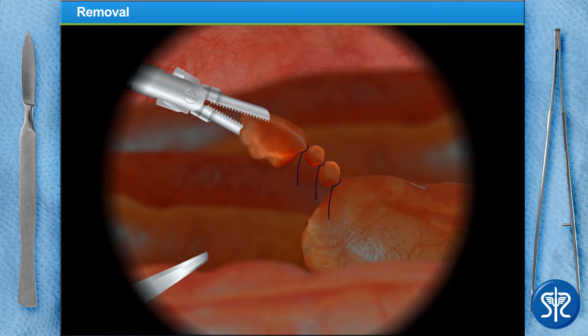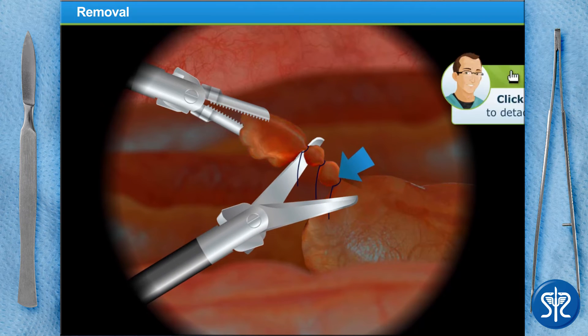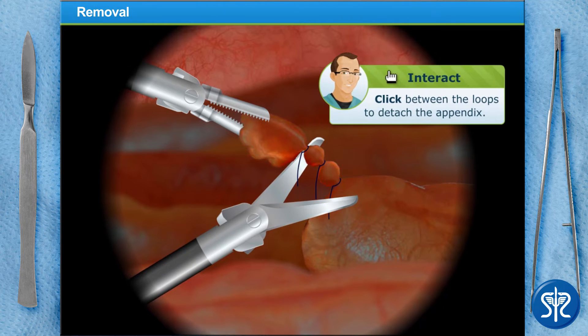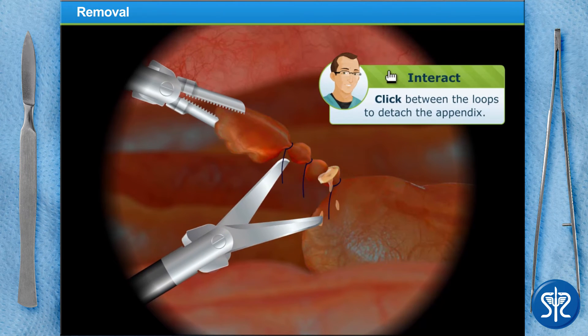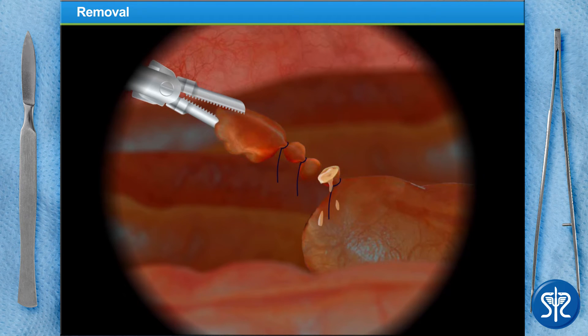Use the scissors to snip between the loops. Notice that when you snip, a little puss comes out, indicating that the appendix is infected. Don't worry about it though, we'll clean up everything.